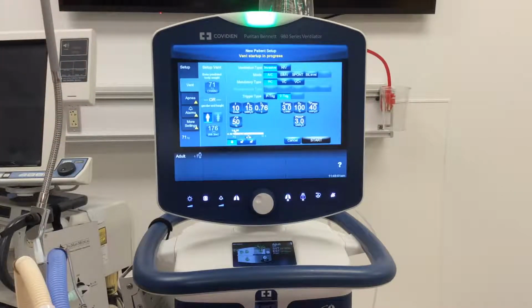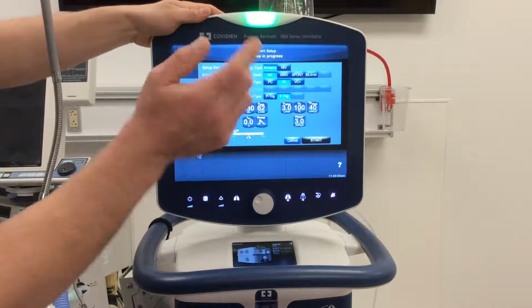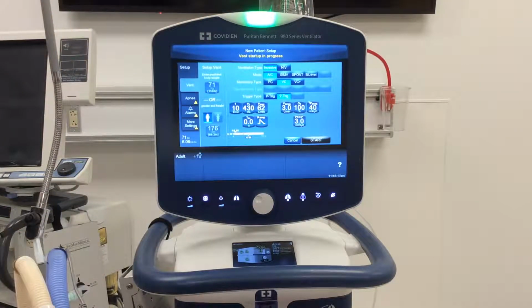Typically in St. Louis, you're going to see a lot more volume-oriented ventilation, at least initially. So PC is pressure control. VC is volume control. Instead of locking in a set airway pressure every single time, we can be assured that the patient is going to get a tidal volume that we deem appropriate for that patient. We're going to talk more about how to come up with truly ideal ventilator settings for our patients as we get further into the class. For our purposes right now, I'll pick some generic numbers as we go through, but it's very important that we give an appropriate size volume, and we'll talk about what exactly that is for certain patients. All of it, just as we did in the non-invasive realm of things, is based upon how many mils we're given per kilogram of ideal body weight.